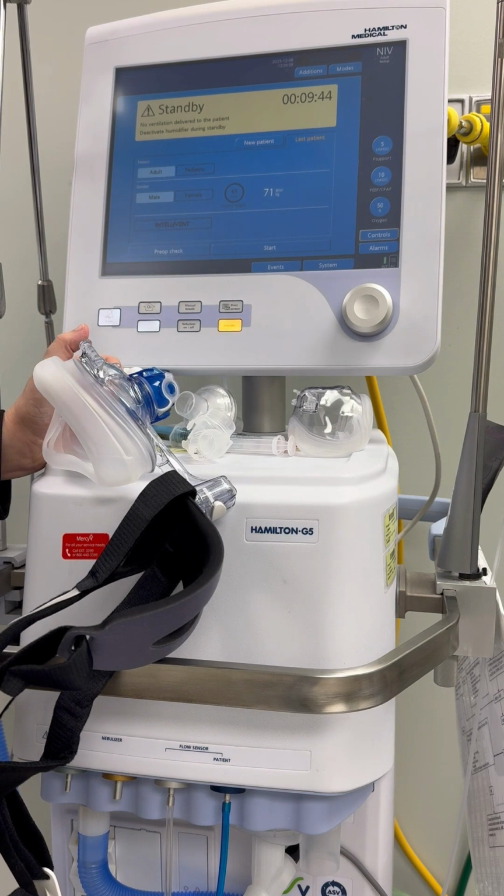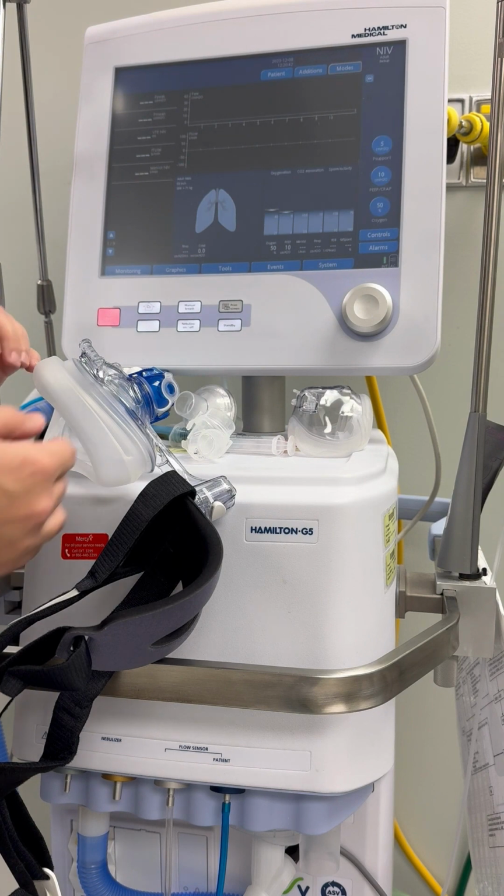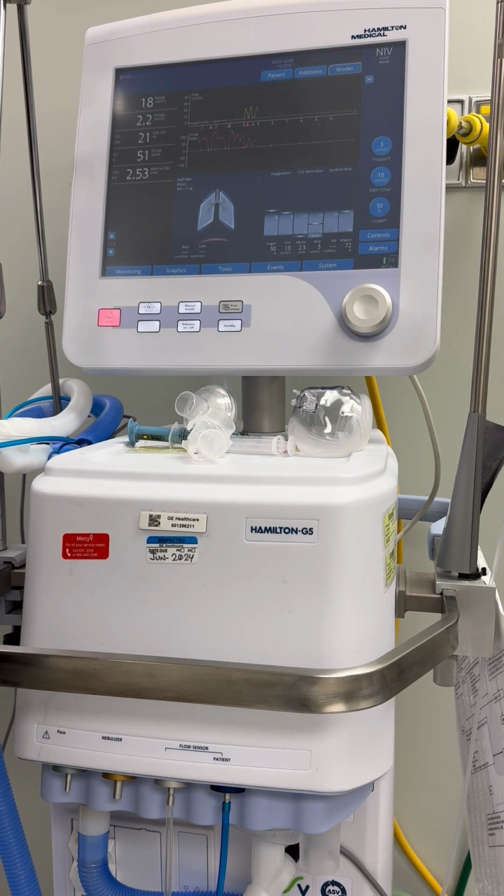So when you're ready to place it on the patient, you will hit the start button. So as you can see, your screen looks very similar to what you're going to see in an invasive mode. It looks exactly the same. So here you can see all of your data.